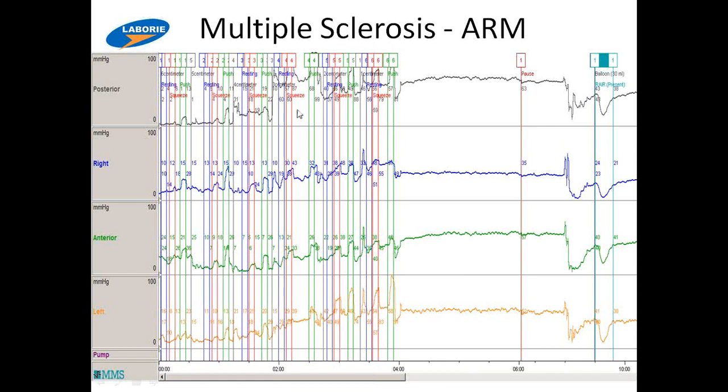Her high pressure zone, again, about 3 centimeters. You can see it really take an increase here. Manometry showed a resting pressure of 50 millimeters of mercury and a squeeze that was not much higher than that. I'll show you a couple of those. Here's a squeeze a little higher than the rest. A squeeze a little higher than the rest here. So she actually had decent intrarectal sensation.